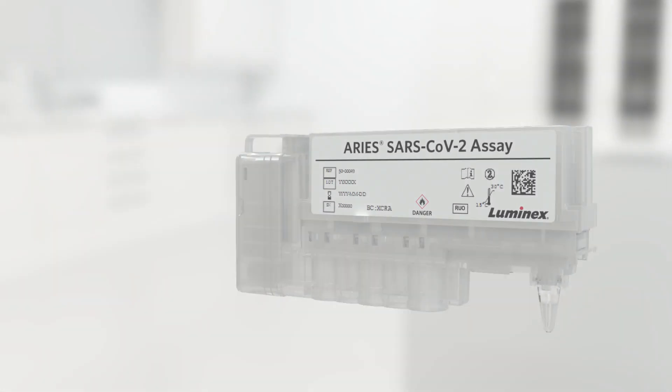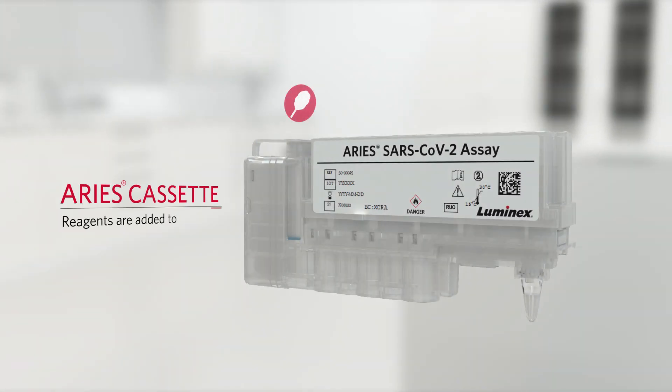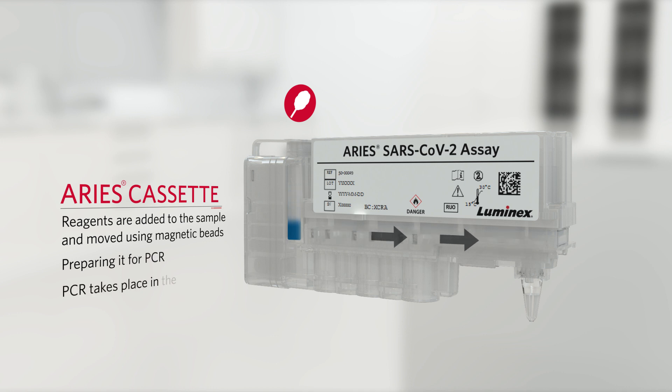During processing, reagents are added to the sample, and the sample is moved using magnetic microparticles through a series of washes inside the cassette, preparing it for PCR. PCR amplification and detection take place in the PCR tube at the opposite end of the cassette.